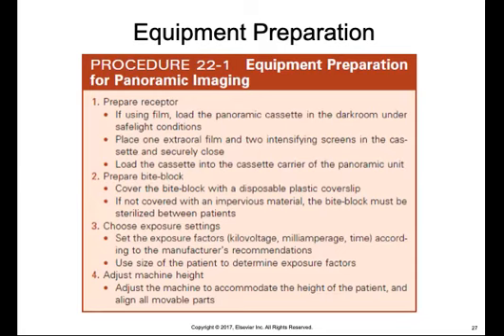And then we want to prepare the bite block. Make sure you cover the bite block with some type of plastic barrier before you ask the patient to bite on it. If it's not covered with any material, it must be sterilized in between patients.